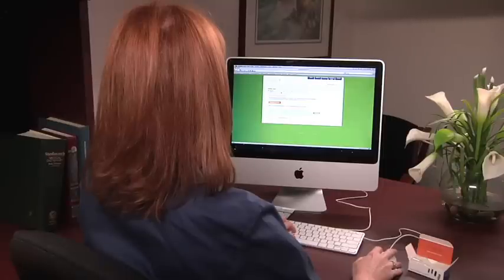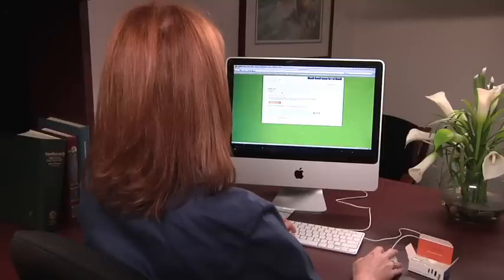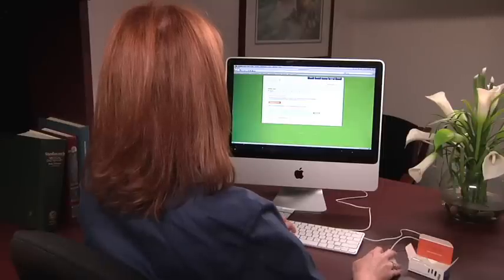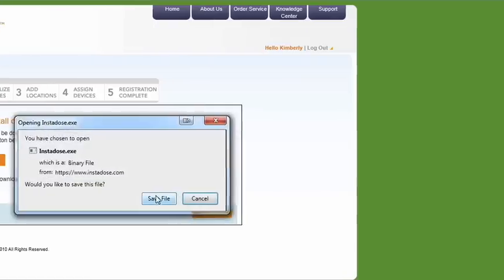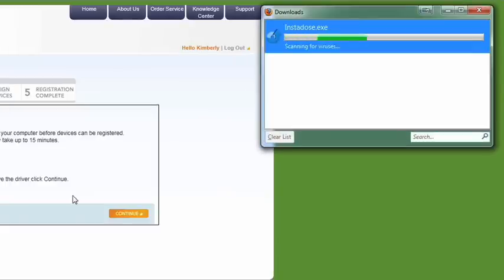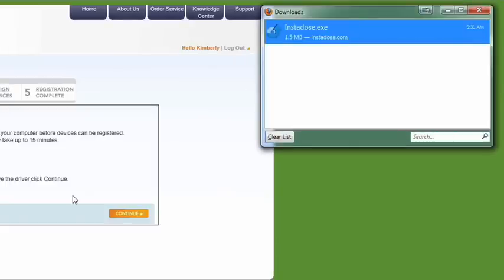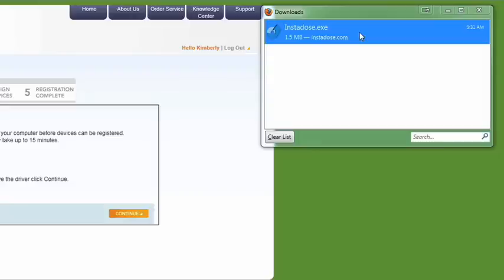Click Download Driver to begin downloading the file. A confirmation message will be displayed. Click Save File to save the file to your computer. Once the file has completed downloading, click on it to begin the installation process.